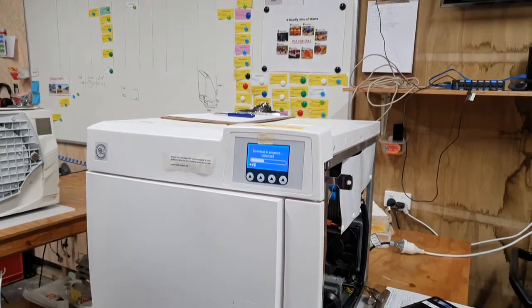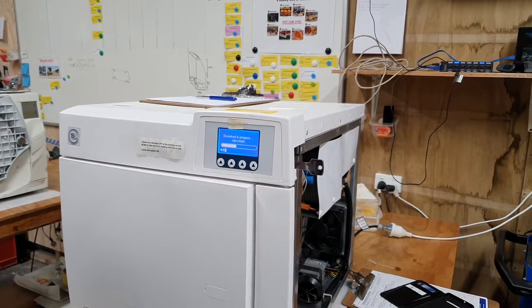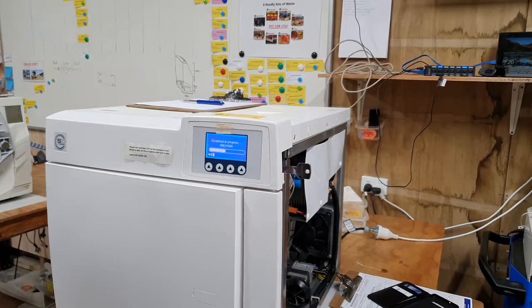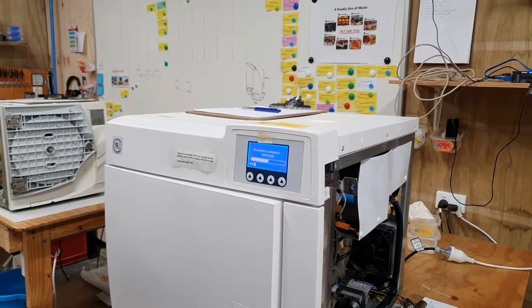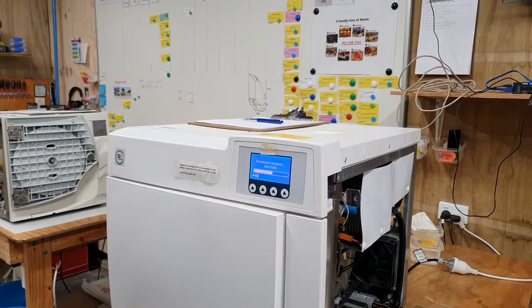So the memory sticks on these can be a little bit fussy, so we want them formatted in the FAT format mode. FAT32? No, FAT. Just FAT? Just FAT. And hopefully that gives us a good result, and the USB sticks need to be less than 2 gigabytes, so the smaller the better.